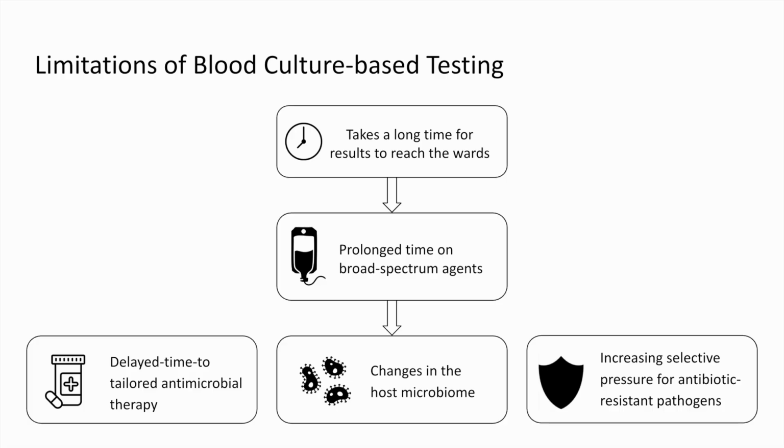Some of the limitations of blood culture-based testing, really they take a long time to reach the wards, and that leaves patients taking broad-spectrum agents for a prolonged period of time. This delays the amount of time until we can narrow antimicrobial coverage, and this can even lead to changes in the host microbiome. We really don't want to be attacking bacteria that aren't causing our patient any issues. And finally, this increases selective pressure for antibiotic-resistant pathogens. So we definitely want to be more conscientious about our antimicrobial stewardship and de-escalate to narrow spectrum agents as soon as we can.